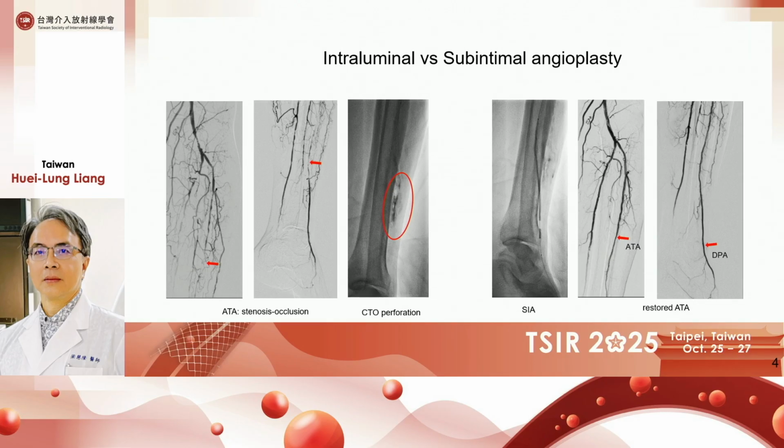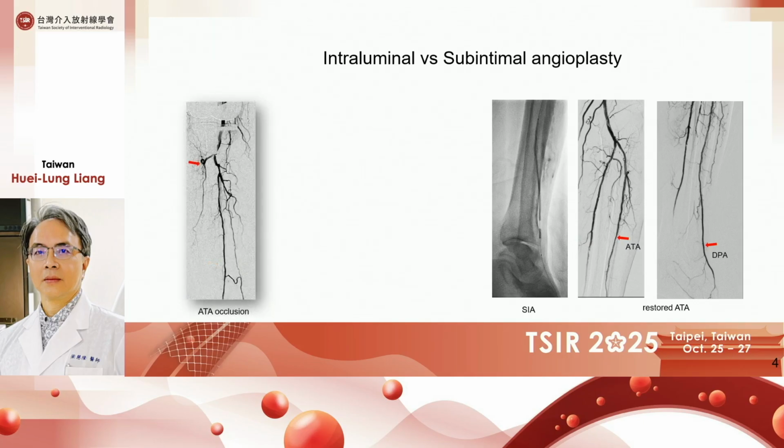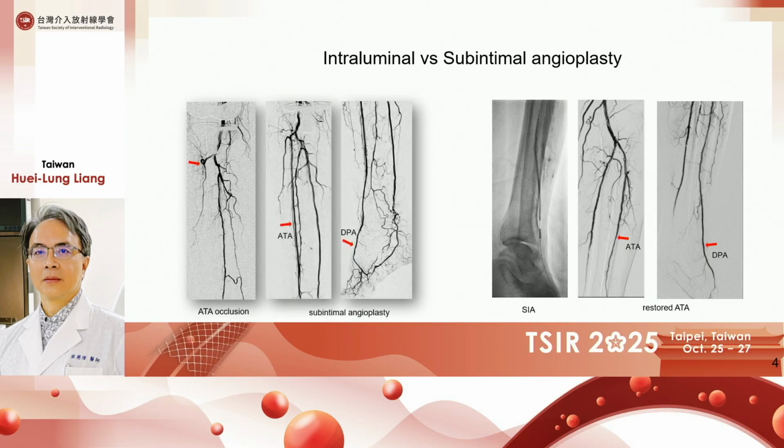A well-restored ATA was recreated. Another case of long segmental total occlusion of the right ATA after subintimal angioplasty. The occluded ATA was restored in minutes.